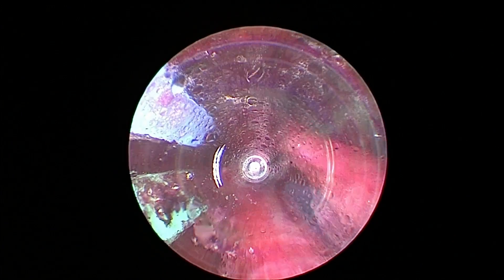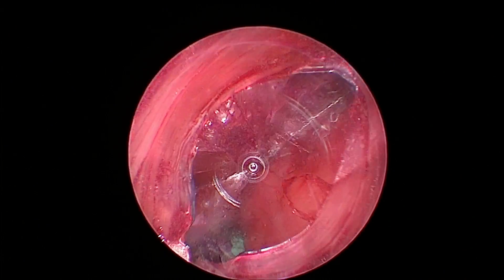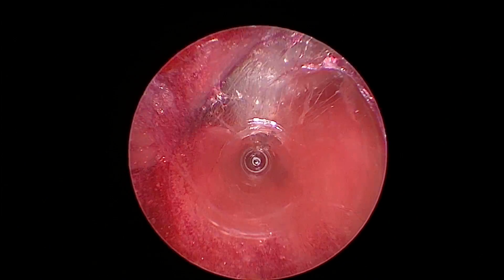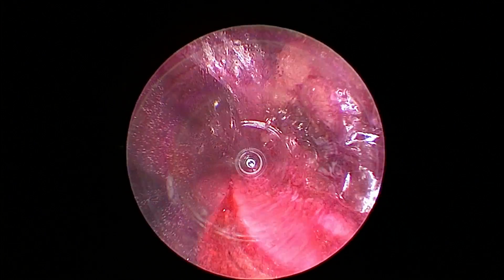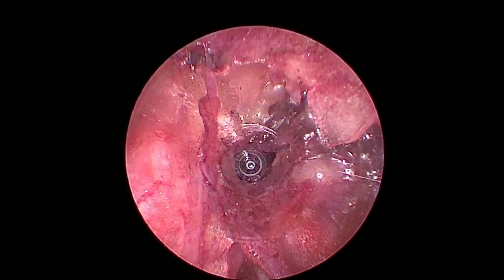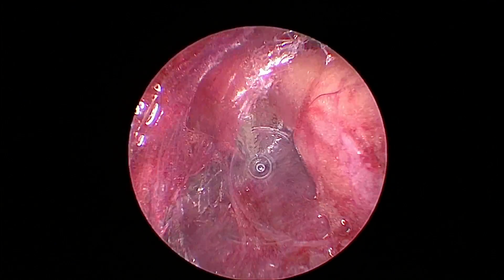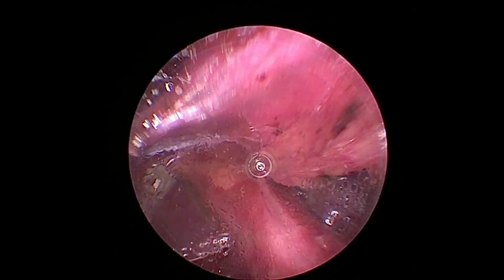I have a little bit of fascia and adventitial tissue here, and I'm going to take it well off the radial artery. I'm not even close to the radial artery with the cautery. I'm working circumferentially — right, left, posterior — just slowly opening this tunnel up in the first two-thirds of the forearm, which is a tight space. Take your time in here and you won't have any bruising or any avulsions of any branches.